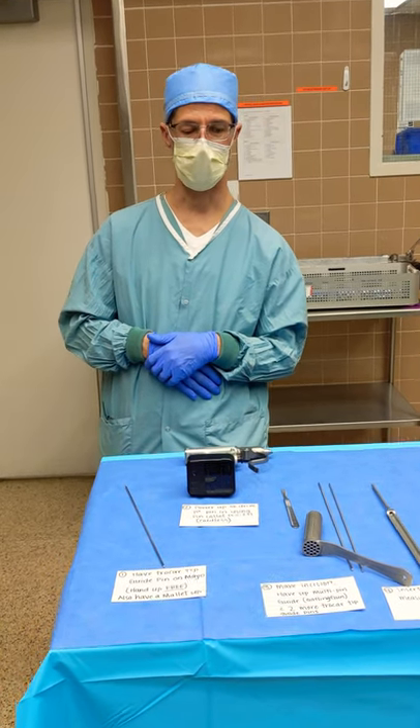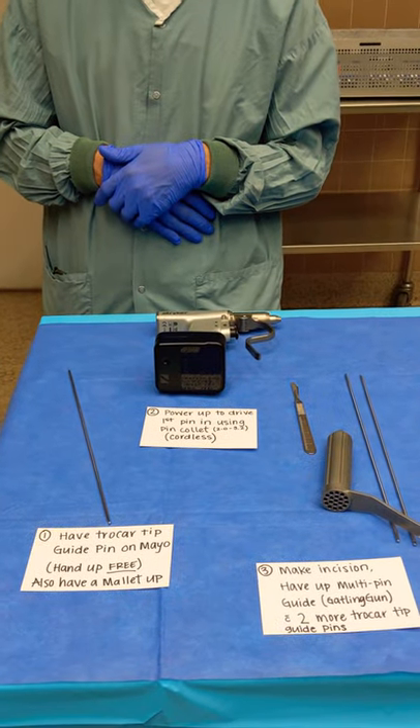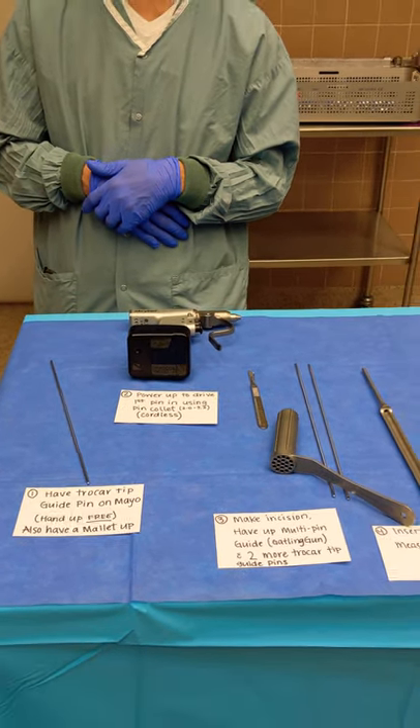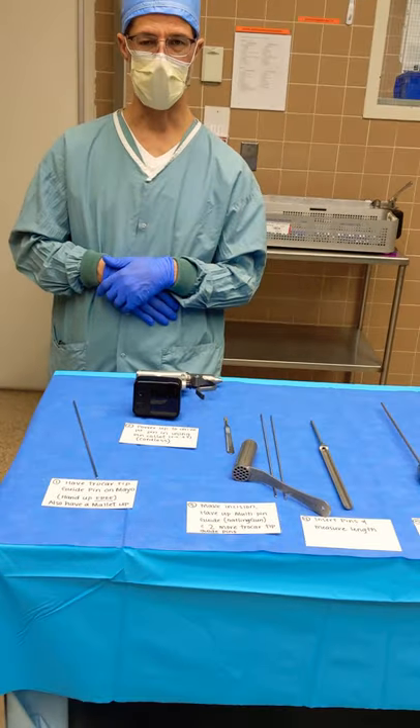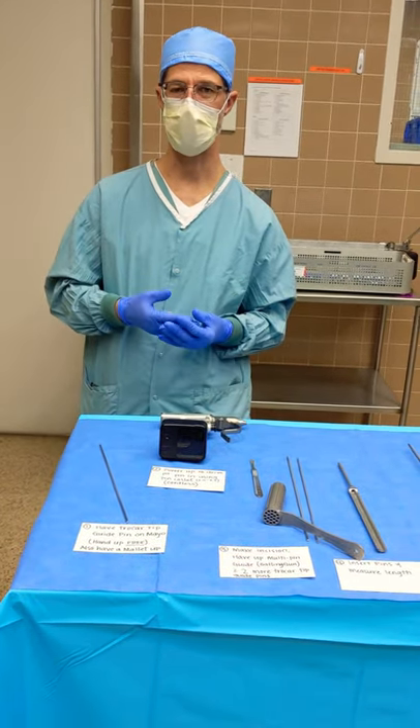We're going to be talking about using the Zimmer 65 cannulated screw system for a hip fracture, otherwise known as a hip pinning.